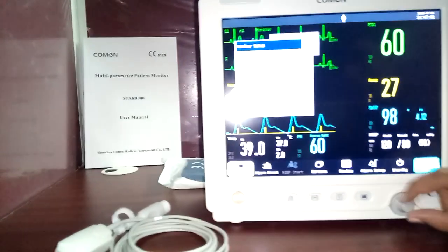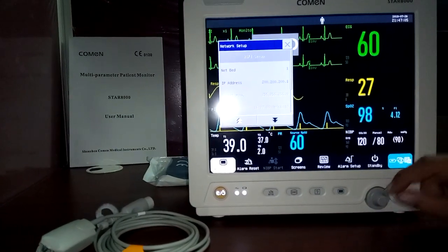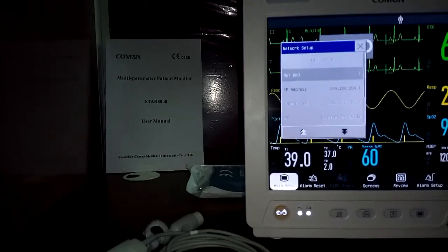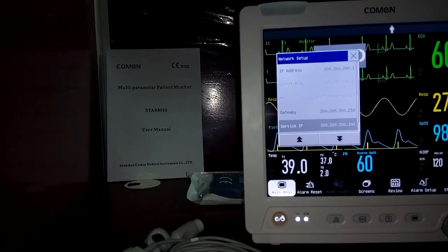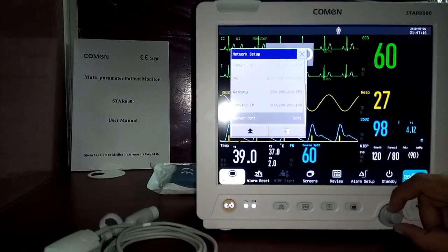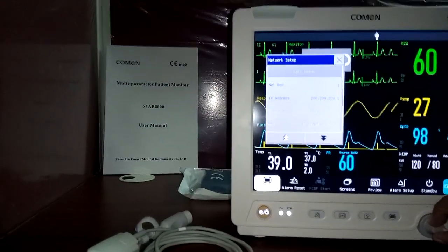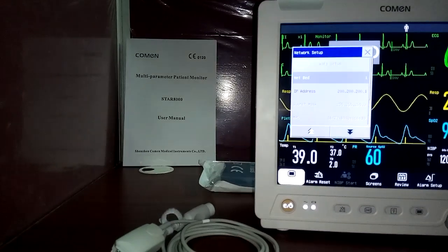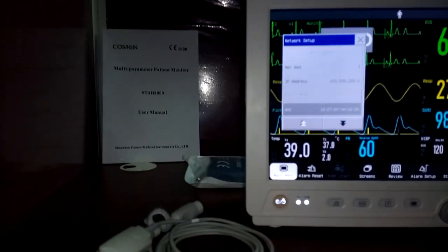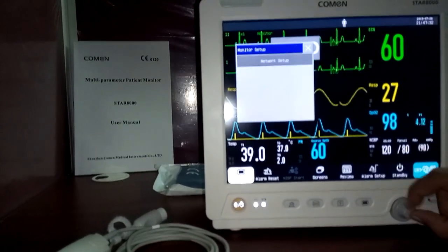For central monitoring station connectivity, go to network setup. Wireless central monitoring is available, but wired connections are recommended as wireless can have issues due to curtains or obstructions in ICU or NICU environments. Your networking or biomedical engineer will configure the IP address, subnet mask, and MAC settings during installation.